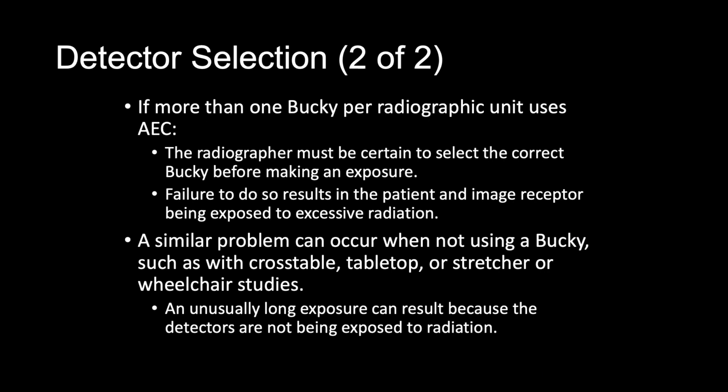Many radiographic units have AEC devices in both the table bucky and the upright bucky. So if more than 1 bucky per radiographic unit uses the AEC, it's very important that we are certain to select the correct bucky before making an exposure. Failure to do so may result in the patient and image receptor being exposed to excessive radiation. The backup timer is reached, the exposure is terminated, and then a repeat radiographic study must be done, increasing the patient's dose.